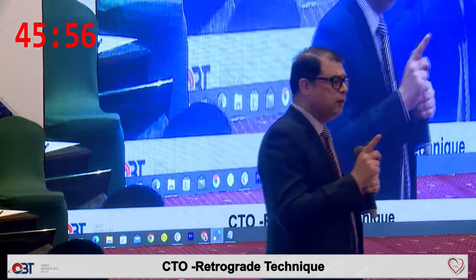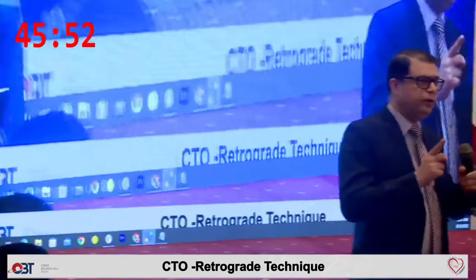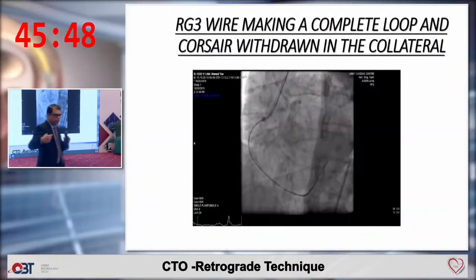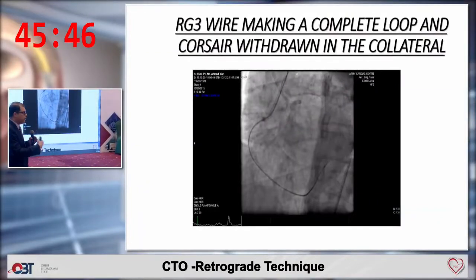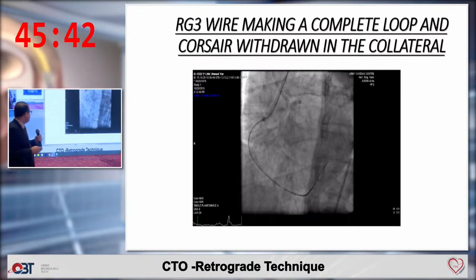Another thing is that once you are using an epicardial collateral, you need to shorten your retrograde guide also. Because if you don't shorten it, you will not be able to externalize the wire. So you need to shorten your guide by 10 centimeters.